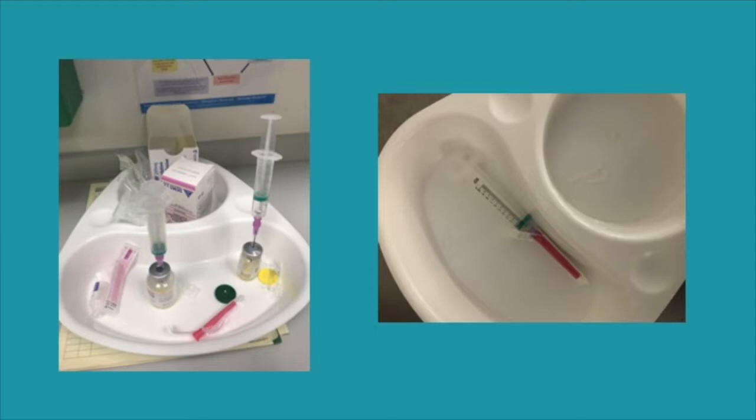Like I said, our lines are needle free, so why take a needle to your patients? And I will show you an example of why we do not need to bring the needle to your patient. Absolutely no point.